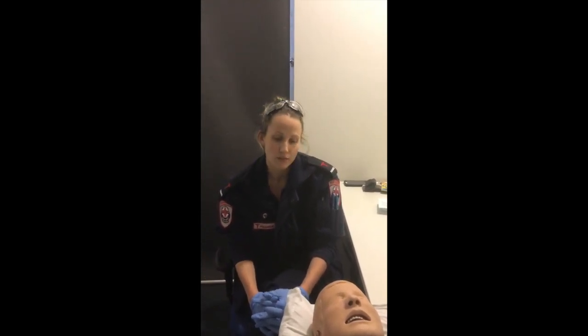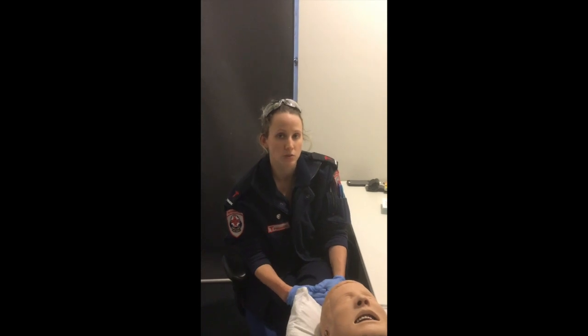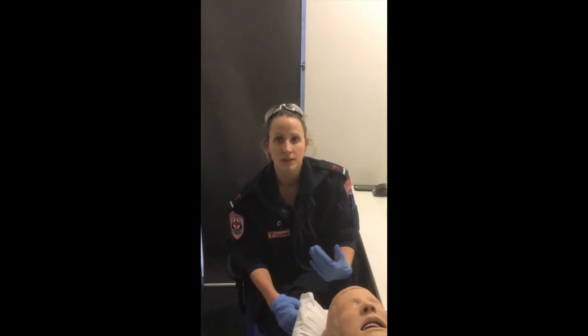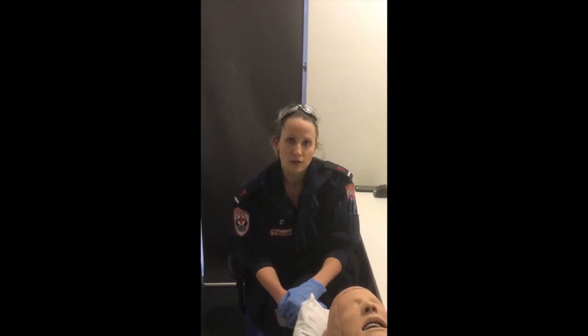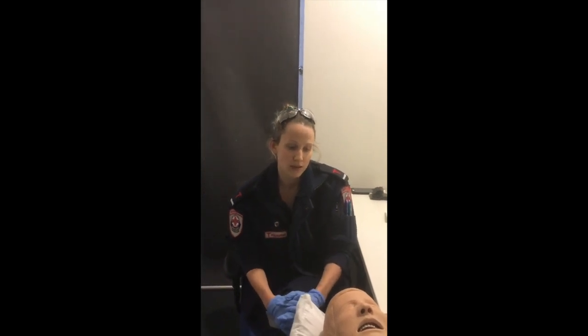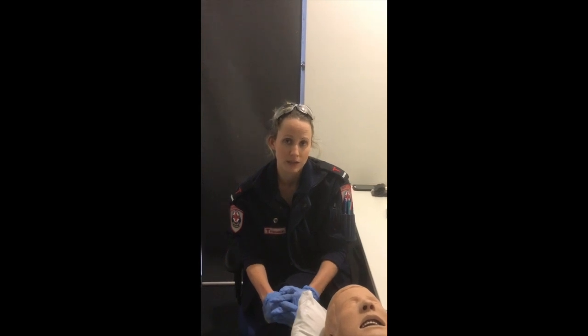So failing 2 attempts at an endotracheal intubation, you may then start to progress further into your algorithm to things such as a supraglottic airway. So again, you can attempt this with differing sizes, aiming for deeper attempts at insertion, lubrication, repositioning. Failing this, you would then be ideally aiming to try and oxygenate the patient in a can't intubate scenario.